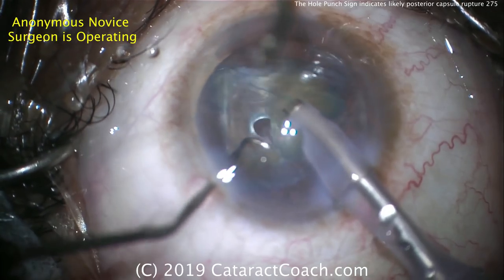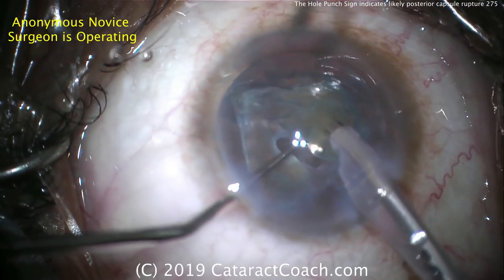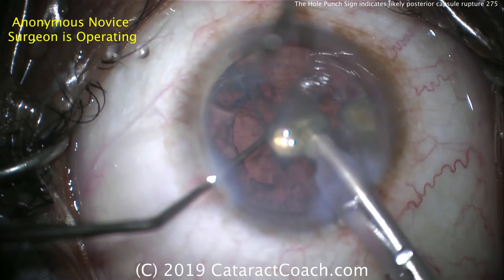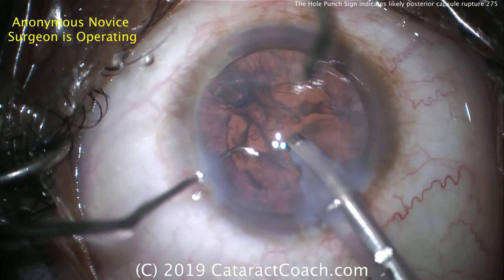This last piece should be removed very cautiously. Do not sub-chop it any further — leave it as one big piece so we can get it all out. We don't want any pieces to fall through. Any changes in fluidics are going to cause that small hole in the capsule to become bigger. I like the chopper position — that looks good. There's the hole; we can see it just underneath the chopper.